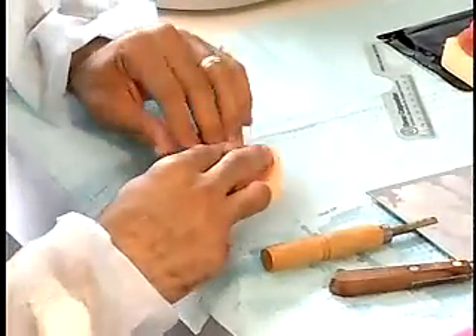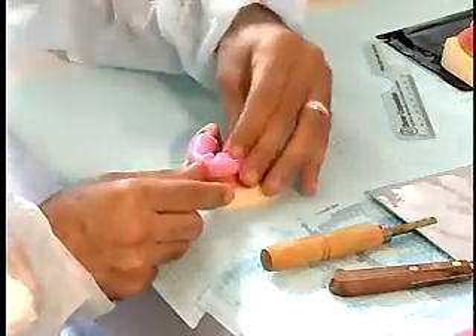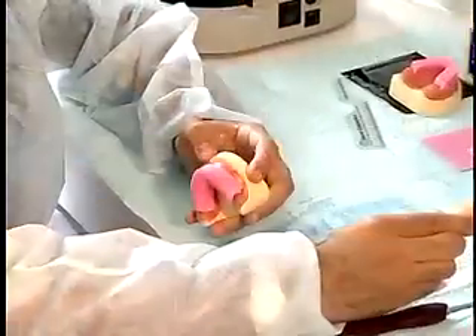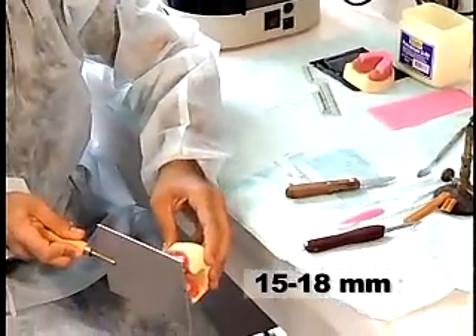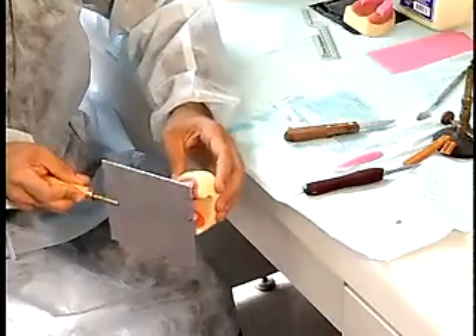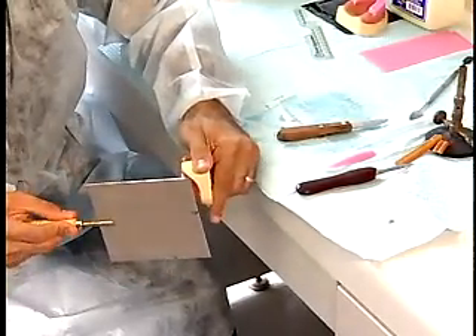Form the wax into a horseshoe shape and adapt the wax to the record base. Make the height of the rim about 15 to 18 mm from the anterior border to the incisal edge. The shape, position, and dimension of the rim should represent those of the natural teeth.